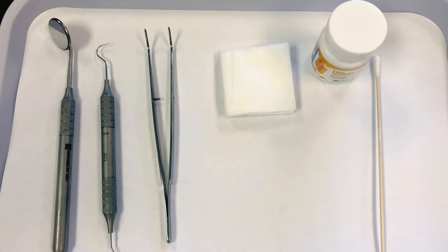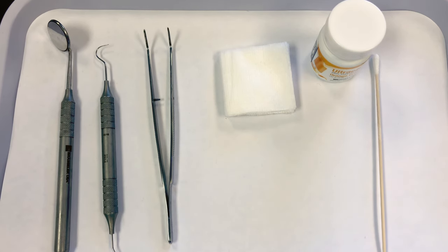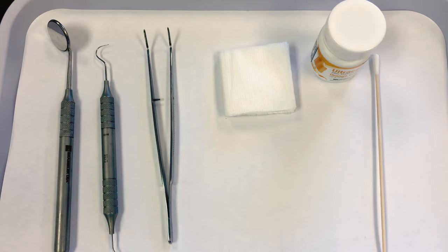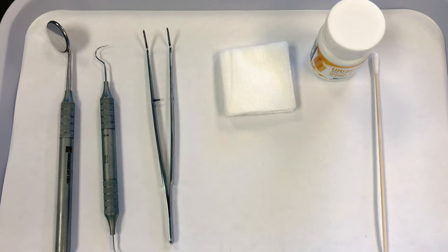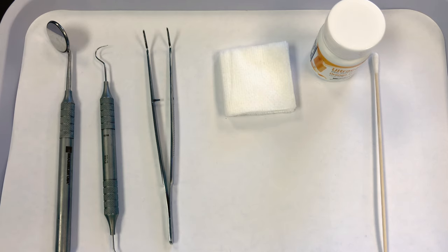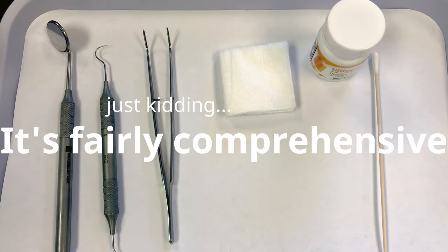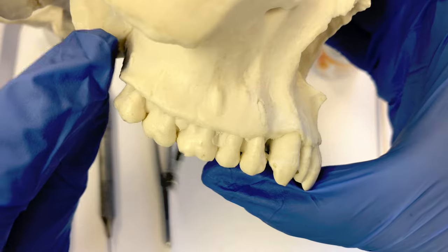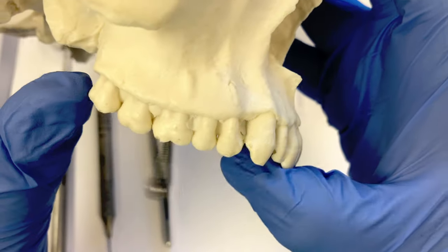This video will demonstrate topical anesthetic placement. We place topical anesthetic prior to the local injection to make it more comfortable for the patient. Before we can jump into the skill, we have to understand some basic dental anatomy. To help demonstrate the anatomy, I have some plastic skulls and we'll go over the maxillary anatomy first. This won't be very comprehensive — it's just meant as a review.